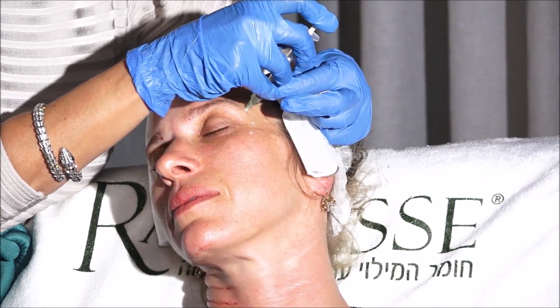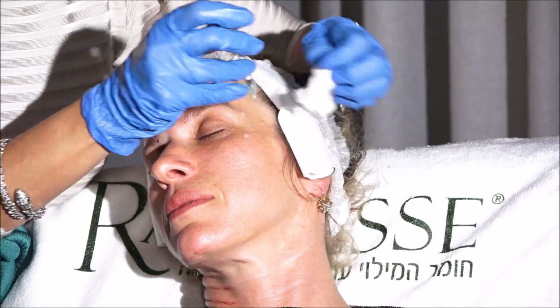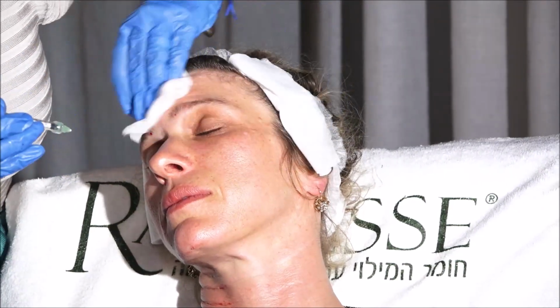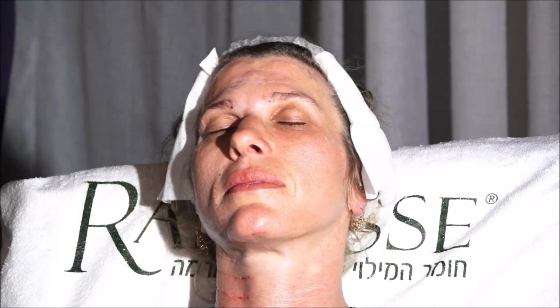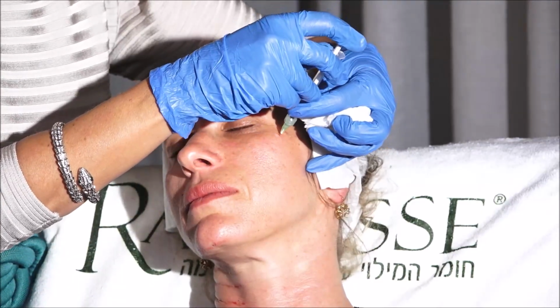So I put 3 units, 6 and 6. Let me take the rest, the tiny, tiny, tiny amount, and inject in this one.